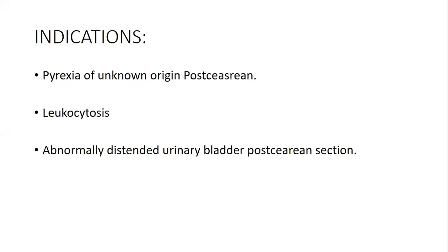And I'll quickly go into the indications which I've already given. So a patient will be brought with pyrexia of unknown origin post Cesarean section, leukocytosis. These are raised white blood cells suggesting infection. Abnormal distended urinary bladder, post-Cesarean section. All these patients may also be presented.